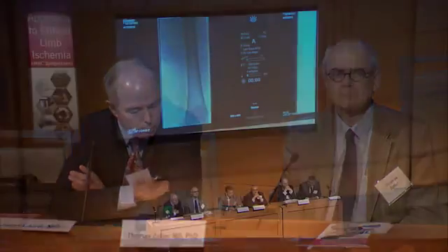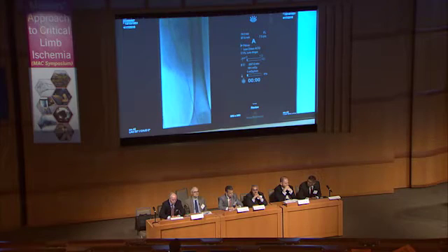So Thomas, because you mentioned Viabahn, my question to you is, do you see the reason to use DCB here or just go with the regular balloon and Viabahn following what John said, saving some cost?